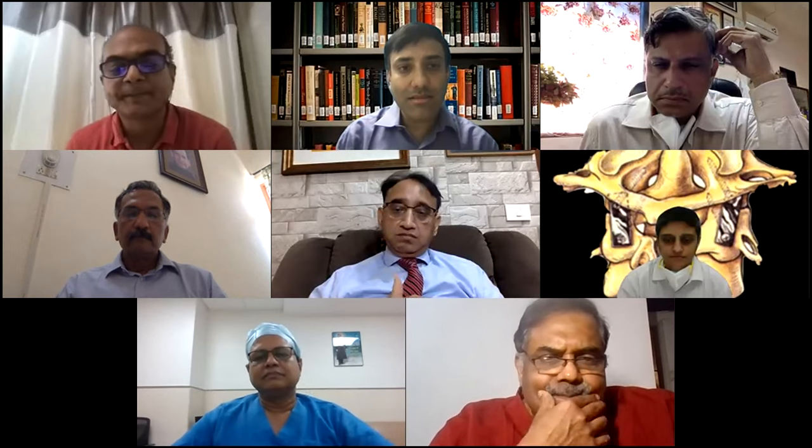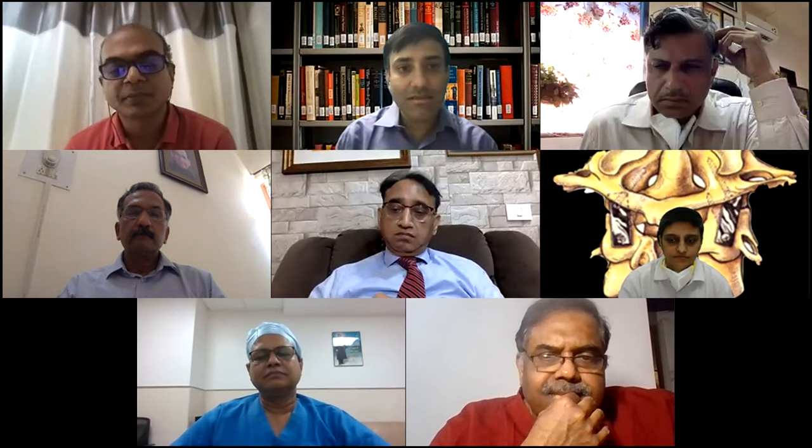What is your opinion? Yeah, I'm sorry, there was some disconnection. I understand. I don't like the expandable cages. From the beginning, it was not going with the concept of fusion at all. It is just putting the beams without putting the cement. And the volume of the graft within that expandable cage is very, very limited.